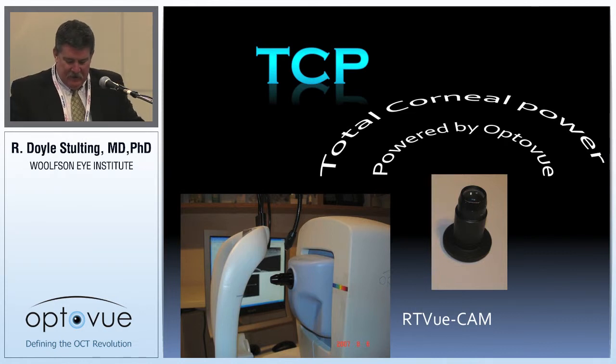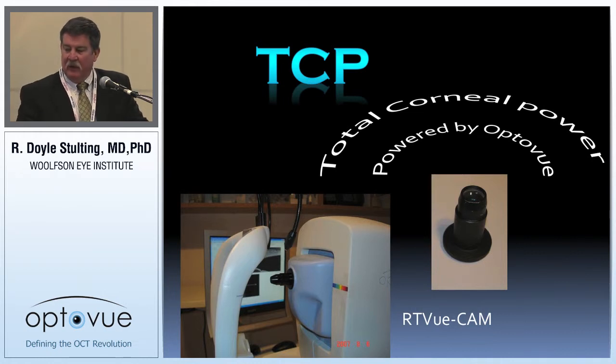More recently, we have started to use it as a method for determining total corneal power, which is in part the subject matter for our discussion today.